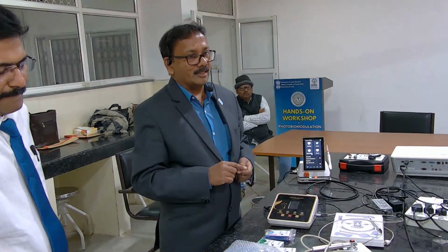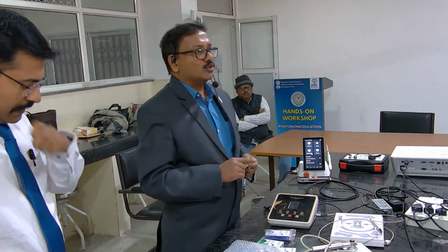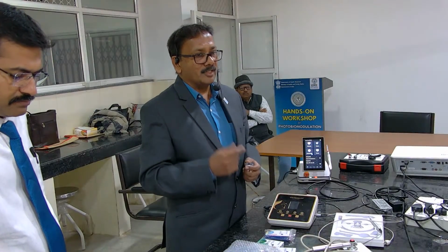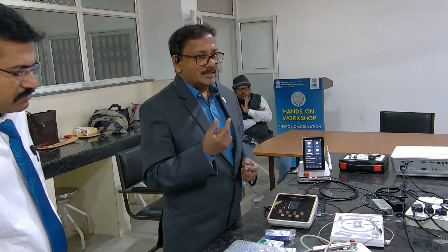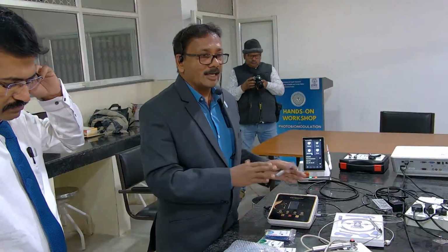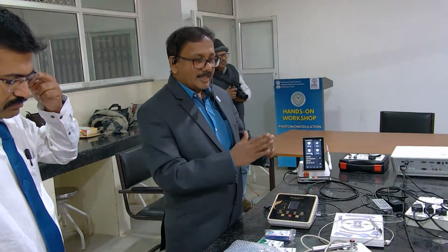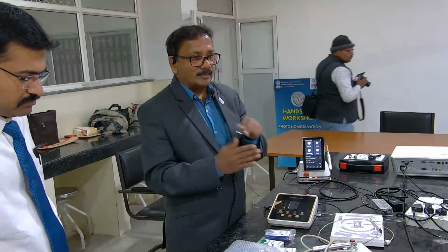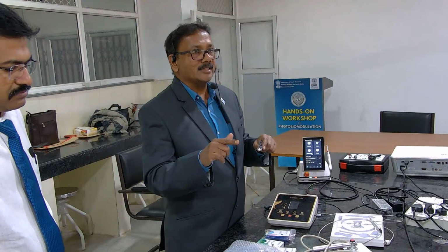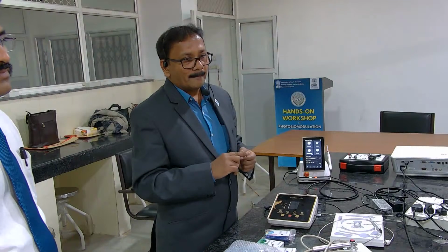the low level laser. Earlier it was called cold laser therapy or low level laser therapy. In 2008 or 9 they all came together and used the term photobiomodulation, because even LED does what the laser does to a certain extent, but it can't compete with the lasers because of the collimation and coherence of the lasers. Once the LED hits the tissues, it is not absorbed deep. Its action stops there. In laser, there will be penetration of the laser energy into the target tissues, right?